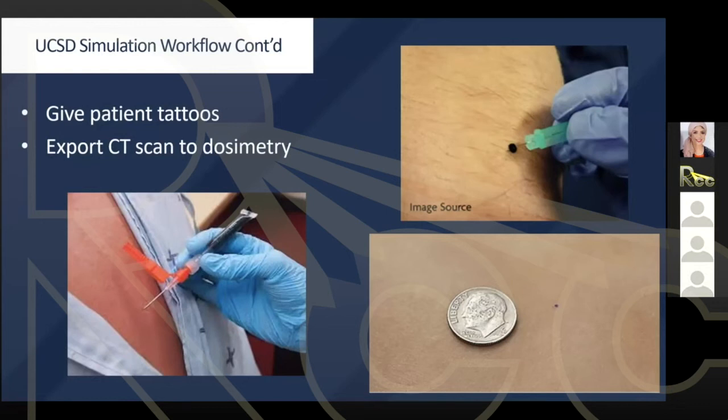The ISO is delivered later, but this is one of the reference points, which is very close to the approximate ISO that the physics is going to calculate upon. Correct. Yes. Okay.